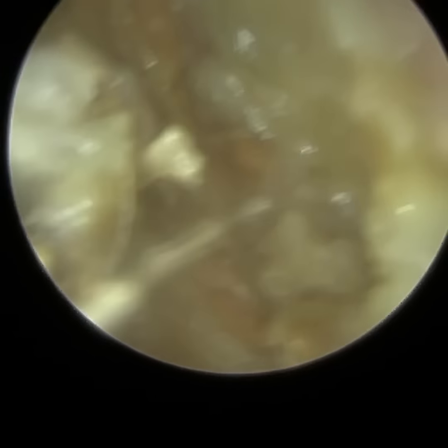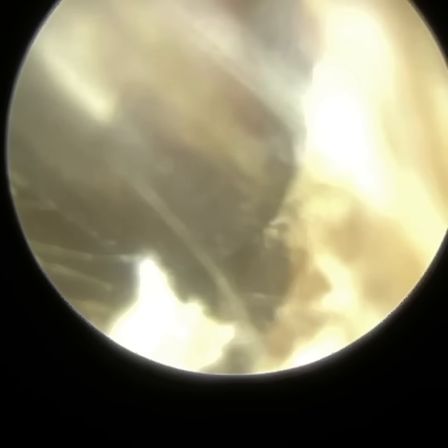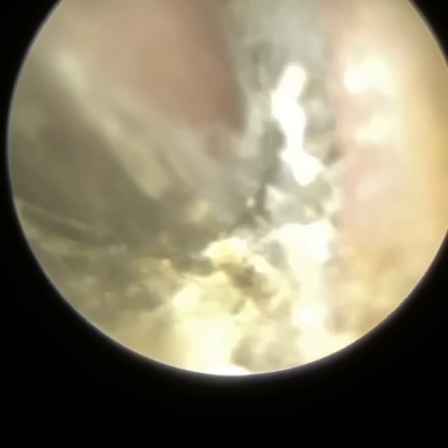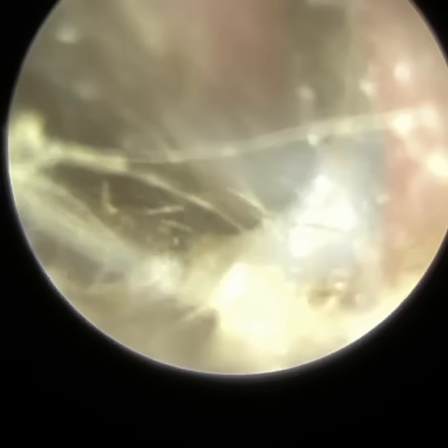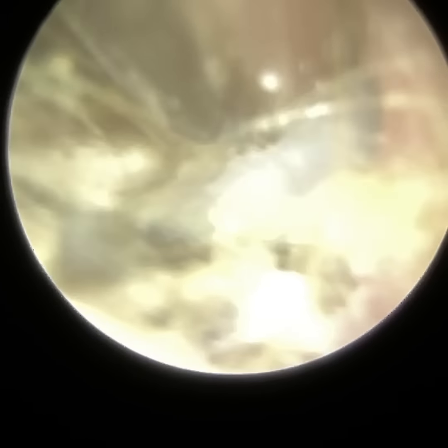The most common cause for chronic otitis externa is fungal infection. You may have noticed when I first went in with the iClearScope that on the right-hand side there were some hyphae, which is very common with Aspergillus, which is one strain of fungal infection. There are also some black fungal spores posteriorly. When someone has a chronic fungal infection, it is very difficult to treat. This patient has been on long-term antifungal treatment, but it's something that we just have to manage.